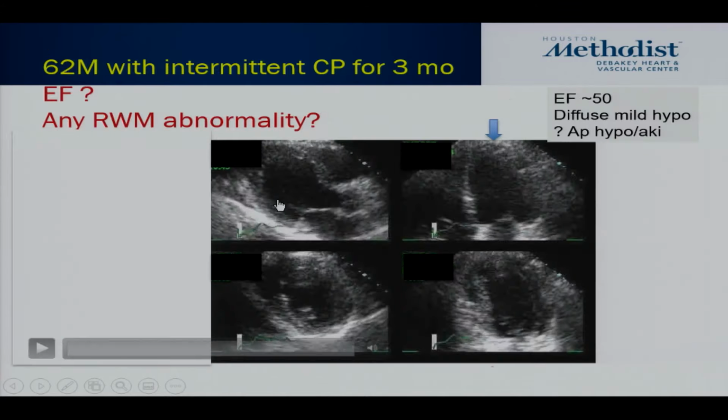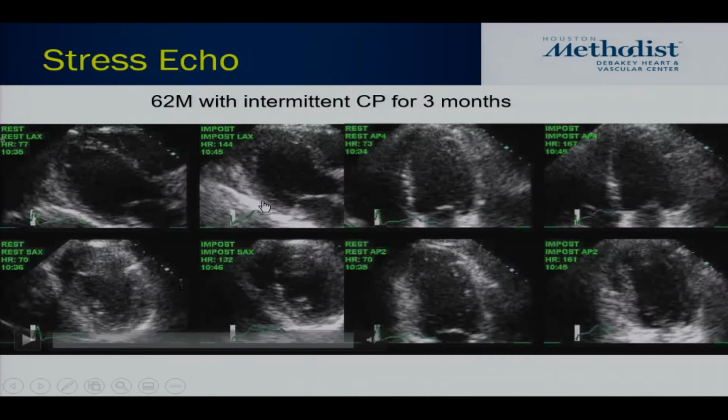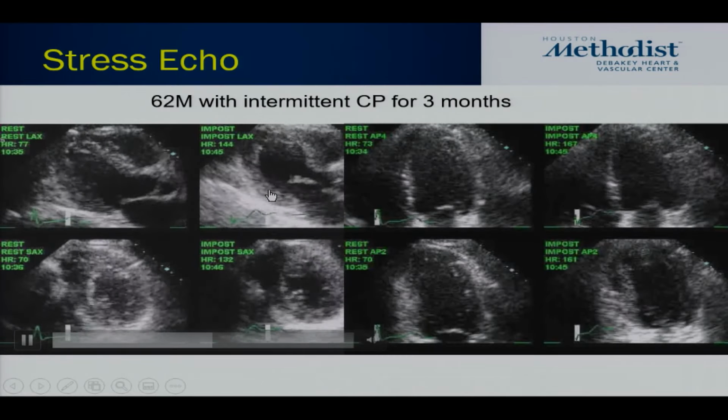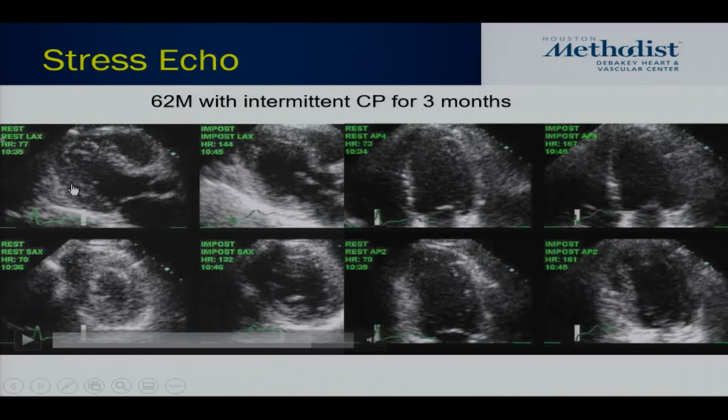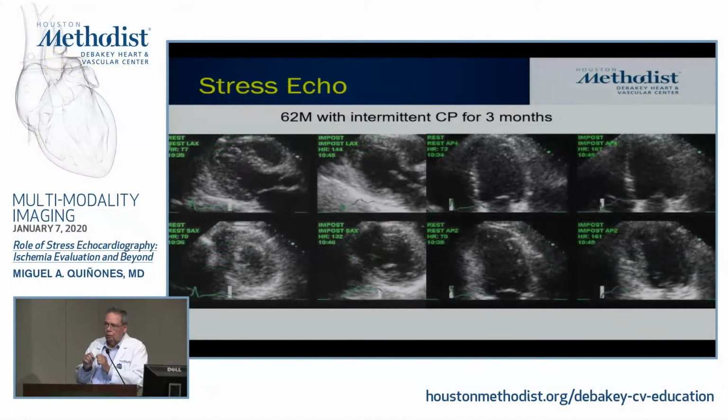And you can see here, if I can stop it on the right time, that now these diameters overall are larger than what we were seeing here at end systole. So cavity dilation at end systole, whether regional or global. In fact, most of the time it's not global, it's regional. If it's global, then you have a really multi-vessel type of involvement. But look for regional end systolic cavity enlargement.